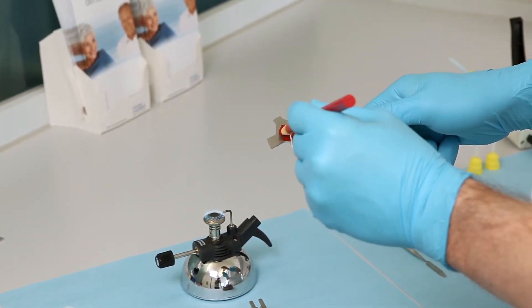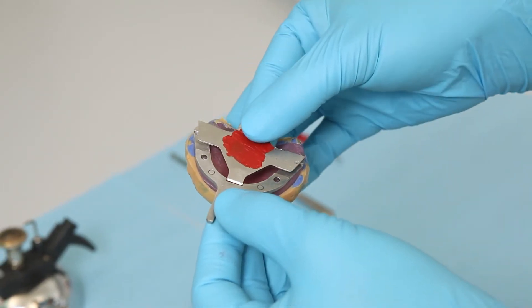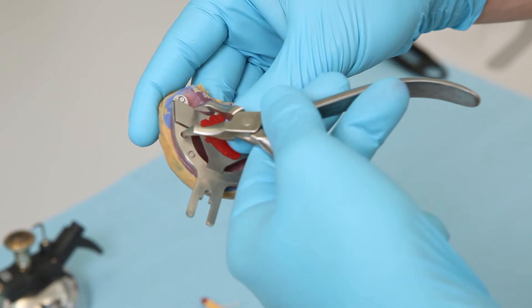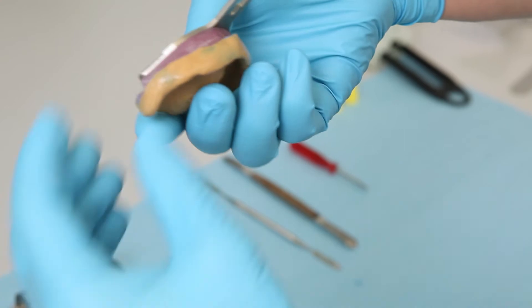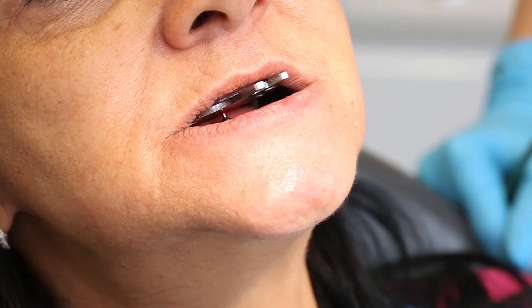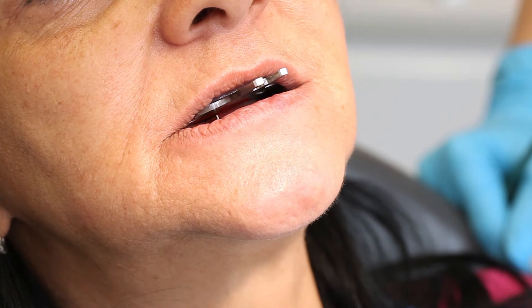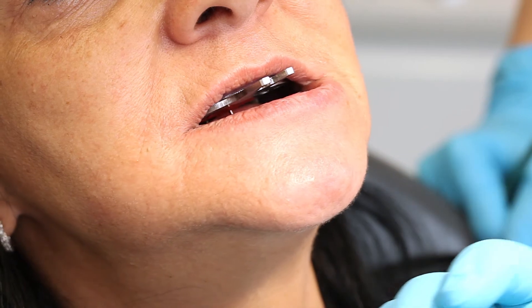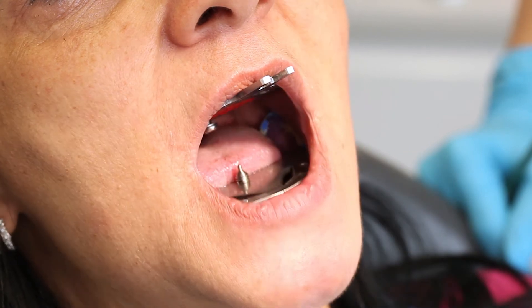Use a wax crayon and Bunsen burner to colour the registration plate. Make sure to cool the plate thoroughly with water after colouring it. Inform the patient about the possible risk of injury before you insert the two impressions together with the mounted Nathometer CAD. The patient's tongue must not enter the space between the plates. The patient carries out protrusive and laterotrusive movements to the left and to the right. You can guide the patient by indicating the direction of the lower jaw movements with your finger. The movements should be repeated three times in each case.